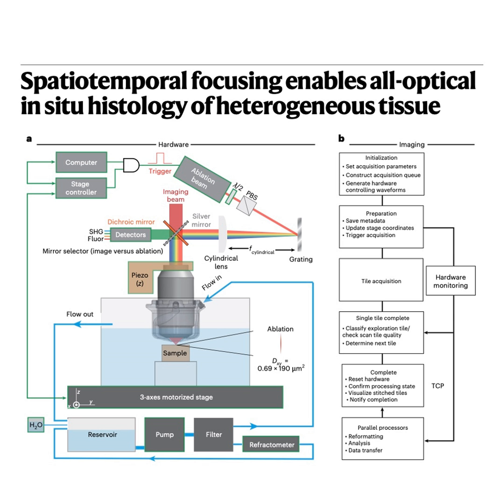This nonlinear absorption generates a highly localized plasma right at the focal point. Think of it like creating a tiny, contained spark or gas bubble. Plasma. Okay, so it's not a thermal burn spreading outwards. It's more like a tiny controlled explosion, confined precisely to the focus. That's a great way to think about it.